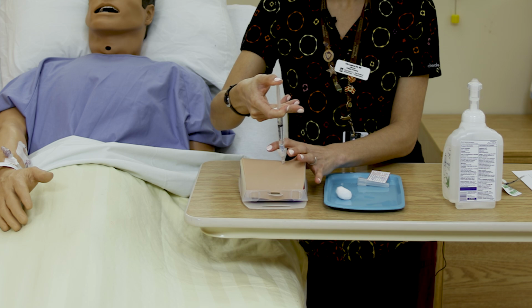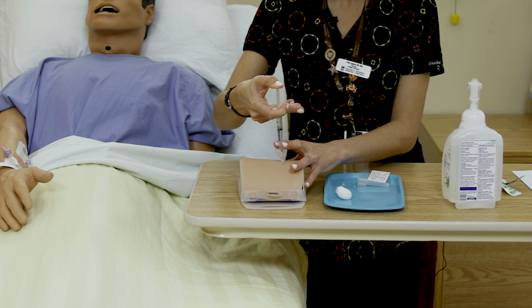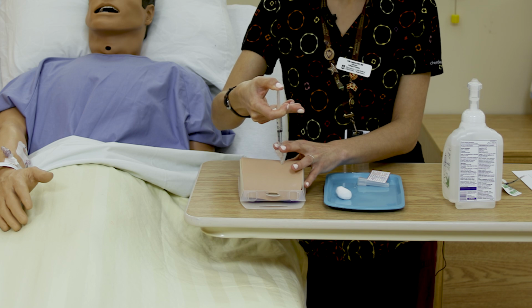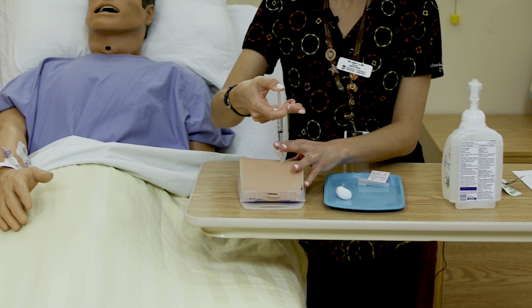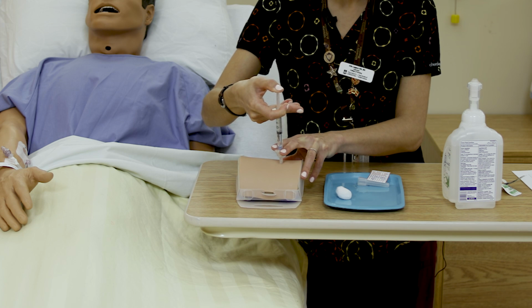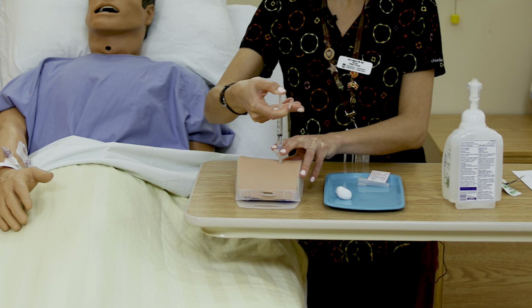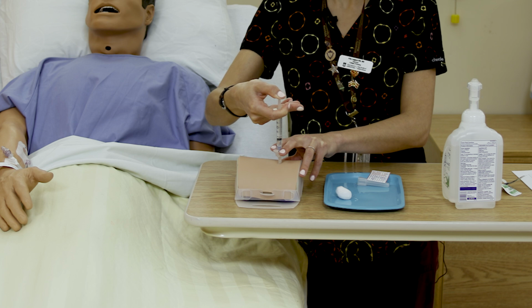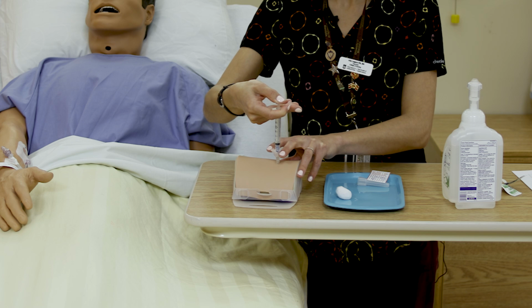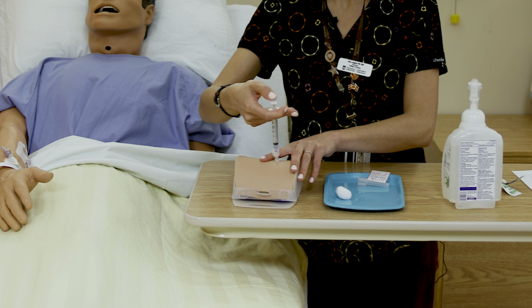So we're going to now slowly inject, maintaining that Z-track pull down here with my thumb. I'm not sure if you can see. I would maintain my stabilization here as well with my 2 fingers; I just don't want to block the view too much of the camera. You'll notice that I'm instilling rather slowly. Most of the literature says to inject at 1 mL per 10 seconds. That seems like a really long time, but the take-home is that you want to inject slowly. You don't want to blast it in. That can be really painful, especially with larger volumes.